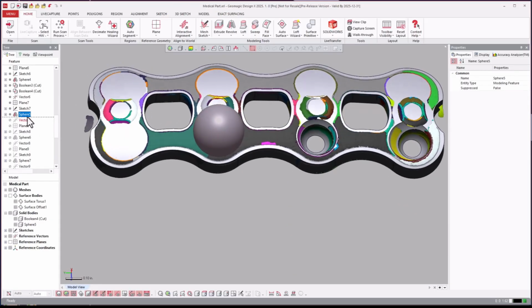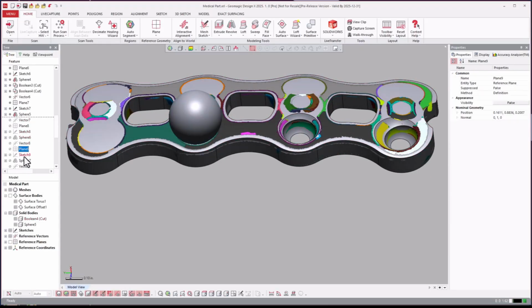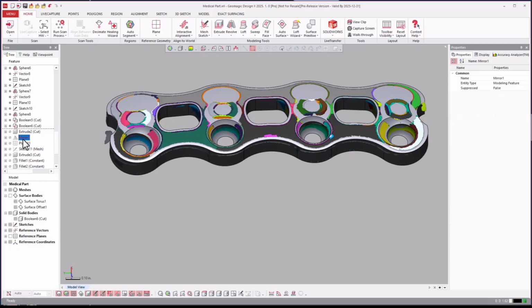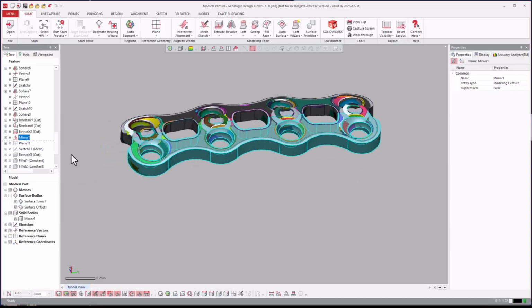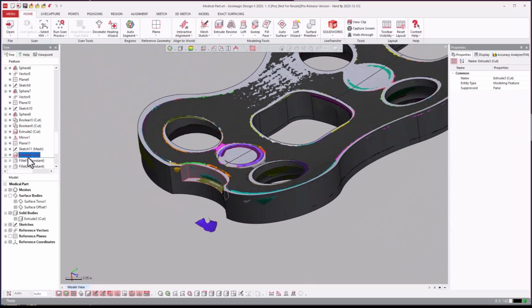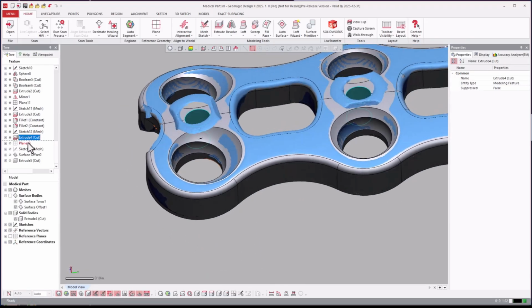And depending on the part, you may be able to pattern this in a certain way, but you'll notice, look at, they're very, very different here for specific reasons, probably. So you see they went ahead and fit those. And then they did mirror it across there. So they went ahead and cut it and mirrored the entire part. And then you can see here they're adding this little pocket here. So we'll turn the regions off so we can see it better. And then there were some more holes to cut in it.